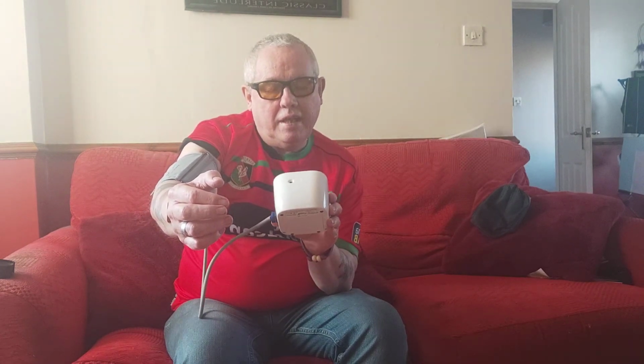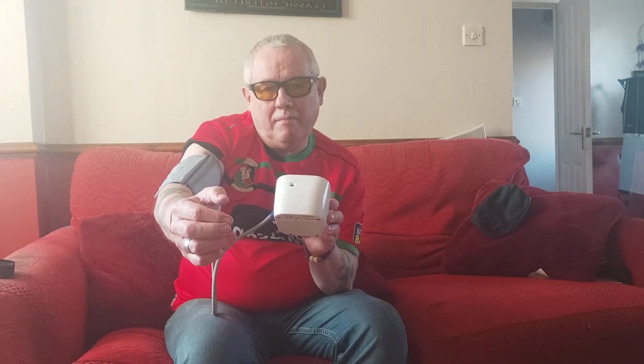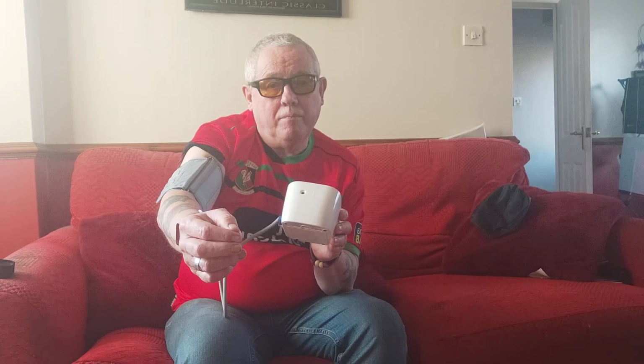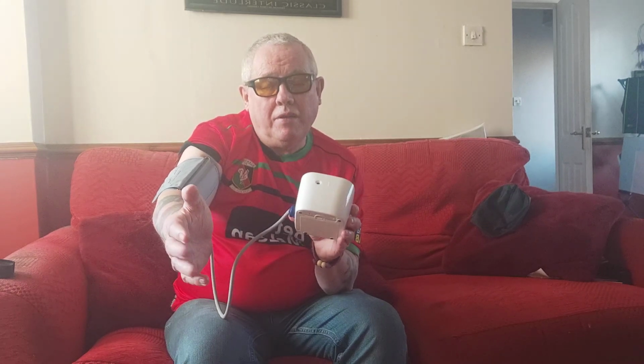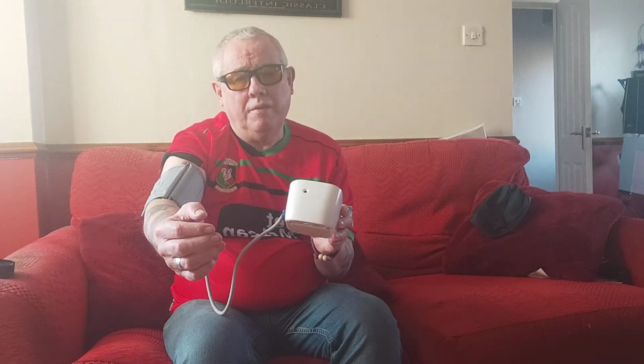The top reading, as I say, should be around 120. That's the SYS, which is systolic, and the DIA, which I think is pronounced diastolic. I could be wrong, but the main thing that matters to me is the figures, and that's what should matter to you. But having a blood pressure monitor at home is fantastic, you know. Anytime you have a sore head, sore eyes, or you have the symptoms of high blood pressure, get the wee machine out and test it.